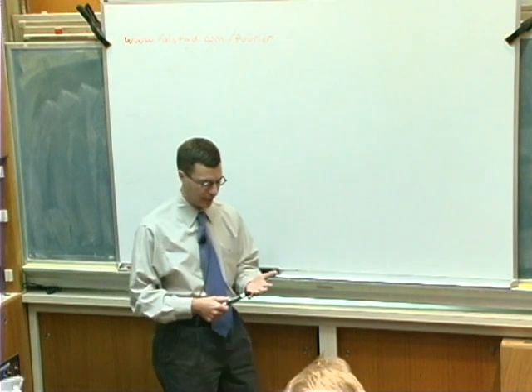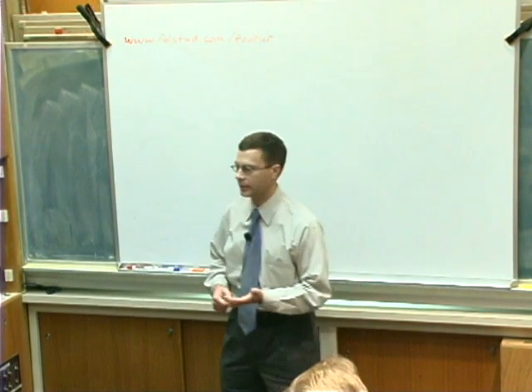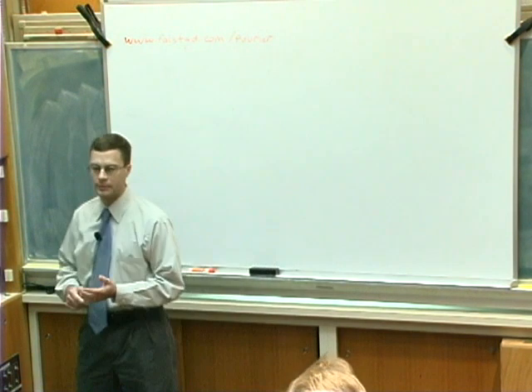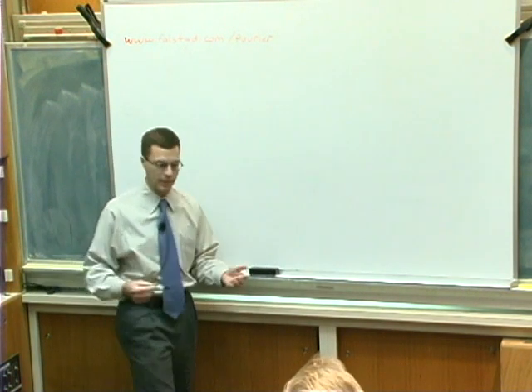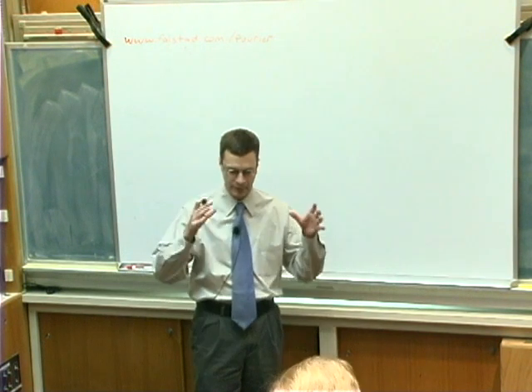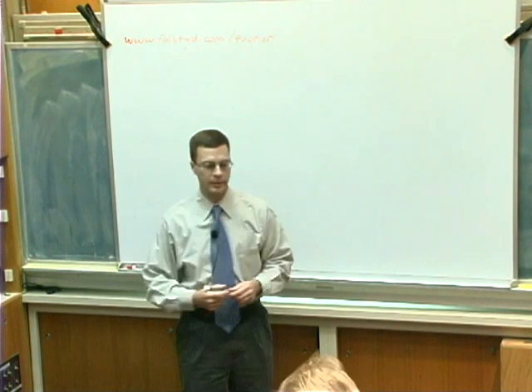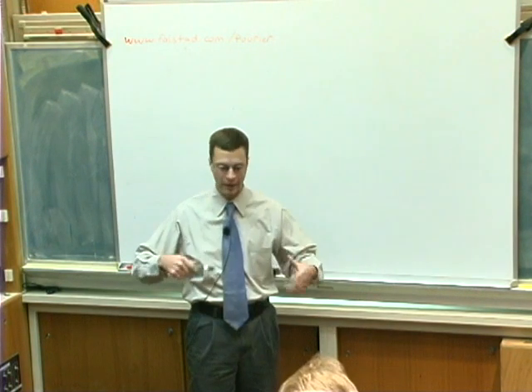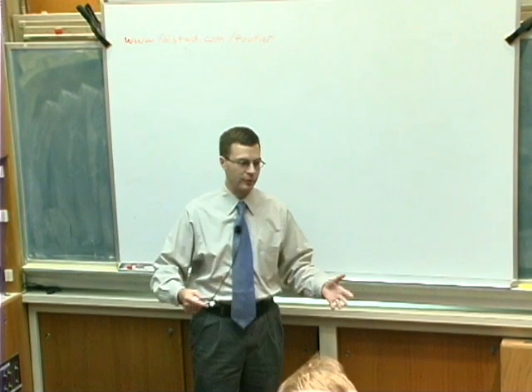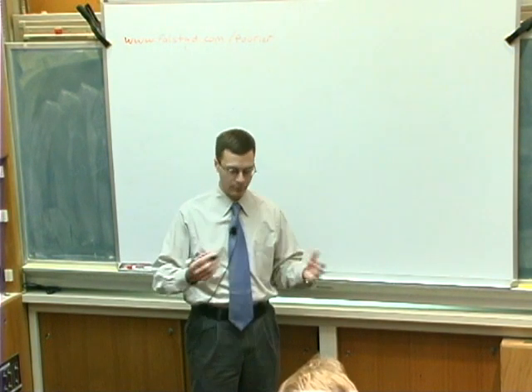So on our first day, we talked a little bit about the physics and physiology of BOLD fMRI data, pretty briefly, but we went over the fact that BOLD fMRI data amounts to essentially volumetric images over time, right? So you have a volume, a picture of the brain that you repeat multiple times over the period of a scan. Each image you acquire about every 2 seconds, and each image is composed of 16 to 20,000 little voxels, or volume elements, which are about 3 millimeters on a side.